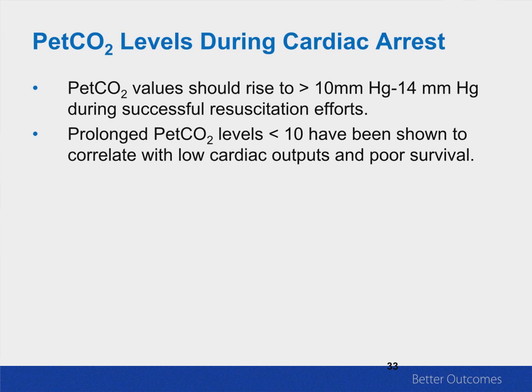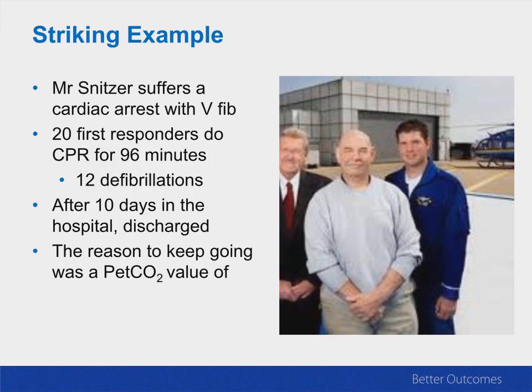So generally what occurs in a cardiac arrest is you lose blood flow to the lungs, with a huge increase in physiologic dead space, and end tidal CO2 is a reflection of cardiac output. So if you have an end tidal level that's less than 10, really at almost any point during resuscitation, but take it out to 20 minutes, you're going to have virtually no survivors. If the end tidal is higher than that, then that's okay. What we wanted to be able to do is just identify people who might have a chance of survival.